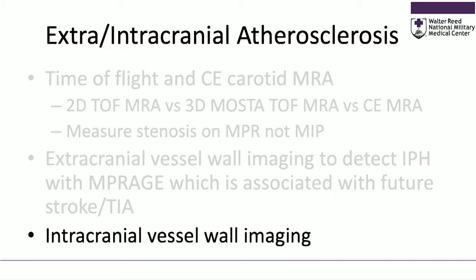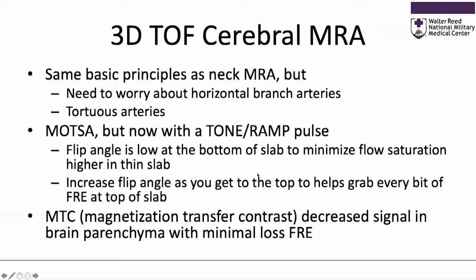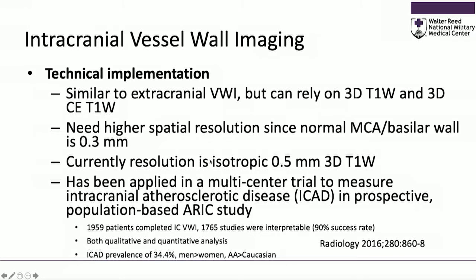And then in the last few minutes, intracranial vessel wall imaging, basically the same concepts as the neck, but we need much better... I'm sorry, this is for MR angiography. The same thing, we just need to do more about the flow saturation. And vessel wall imaging, same concepts, but we need much better spatial resolution. And we'll hear some more about that in a minute.